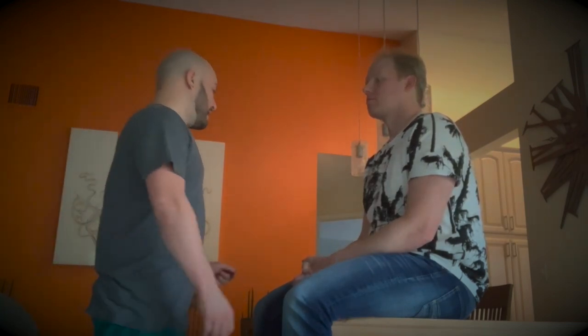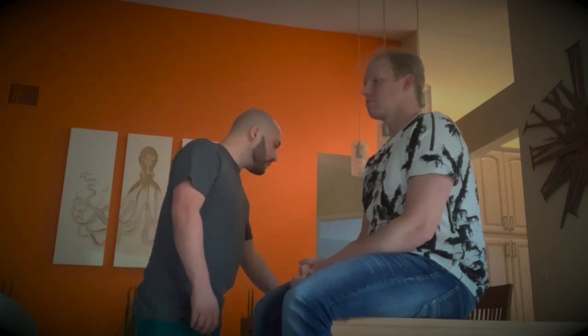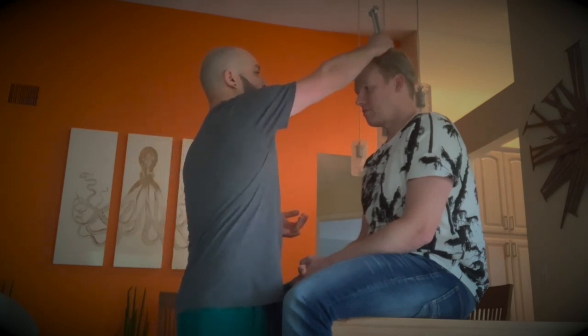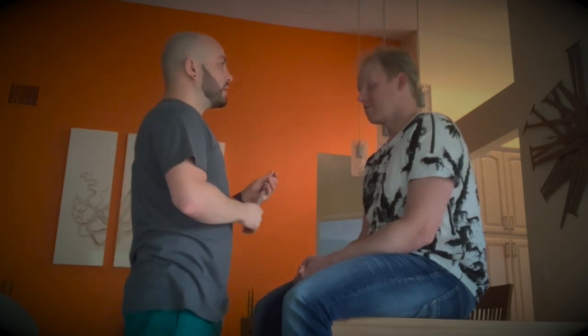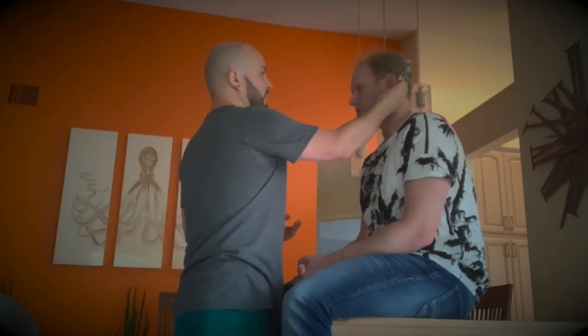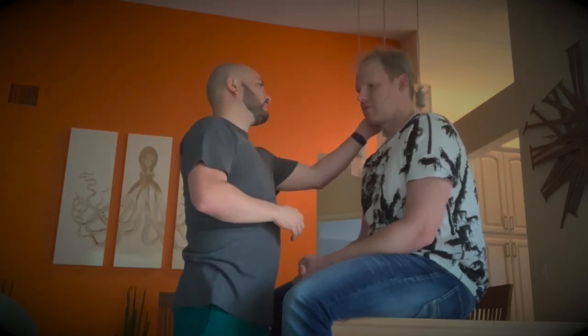Now we're going to do the Weber test, the Rinne test, and the whisper test to monitor for sensorineural hearing loss or conduction hearing loss. For the Weber test, we're going to place the tuning fork on top of your head — let me know if you hear equally on both sides. It's equal. Now I'm going to put it behind your ear and then in front of your ear — let me know if you can still hear it. I can hear it. That's normal.